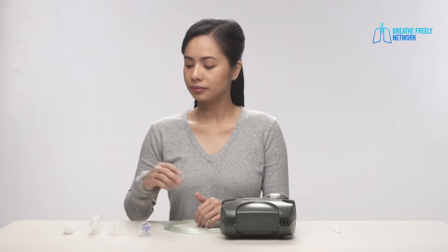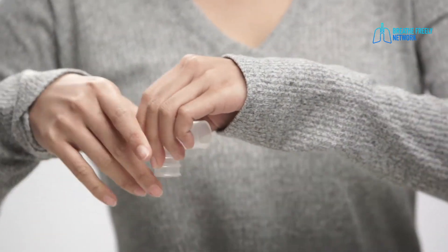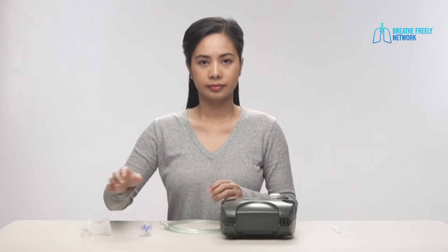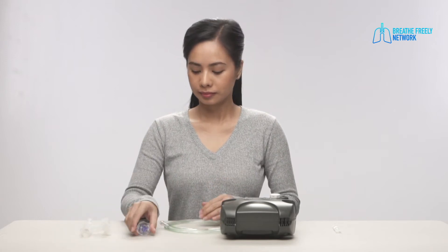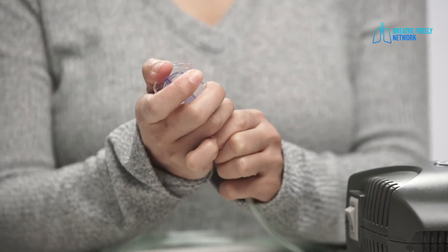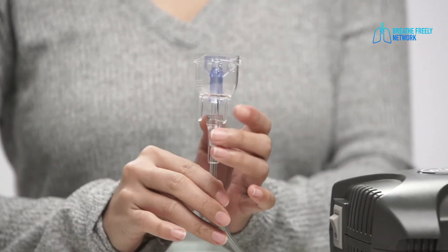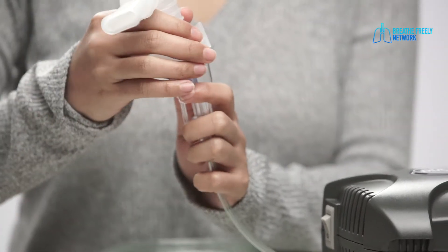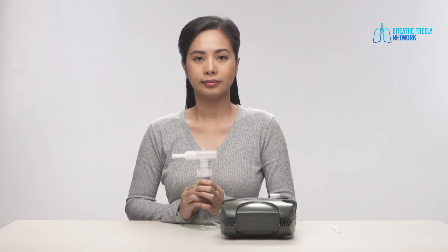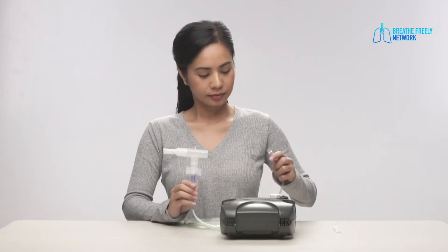Assemble the top piece, tubing, mask, and mouthpiece. Connect the tubing and neb cup. Attach the neb face mask or mouthpiece to the neb cup. Attach the tubing to the machine according to the instructions.